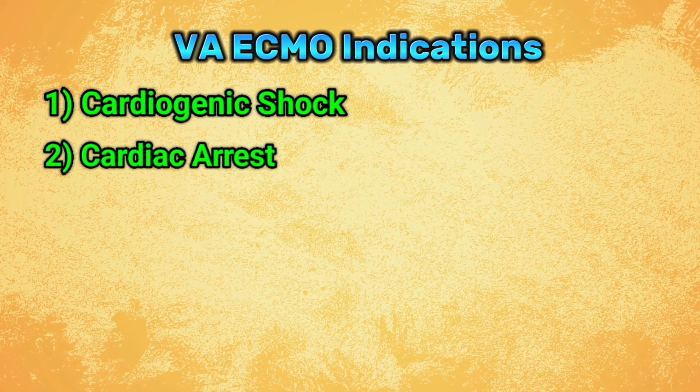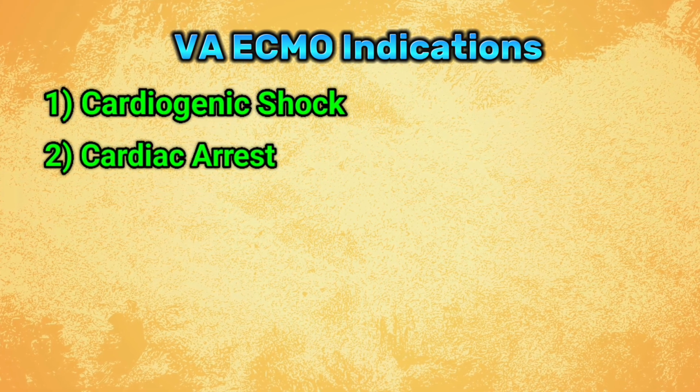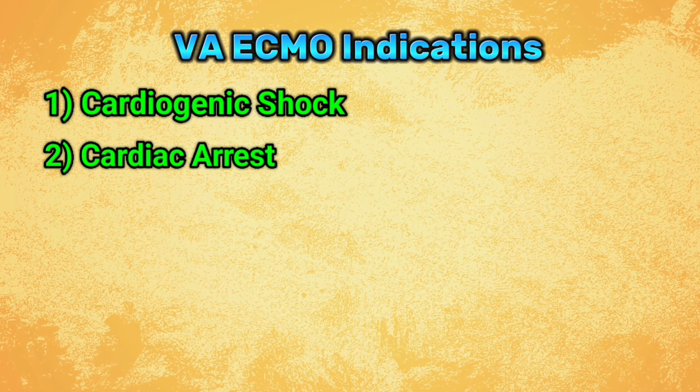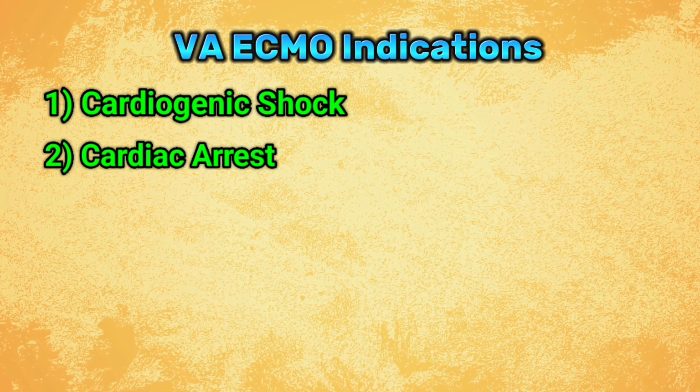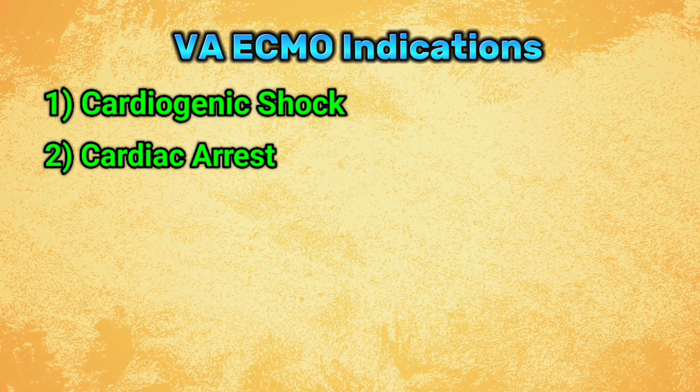Second is cardiac arrest. VA ECMO is used as a part of eCPR when conventional CPR is not effective. After the arrest, if there is no return of spontaneous circulation within 10 to 20 minutes, then there is an indication for eCPR to save the patient.